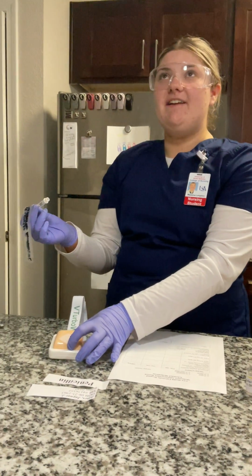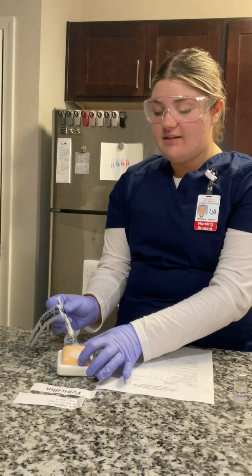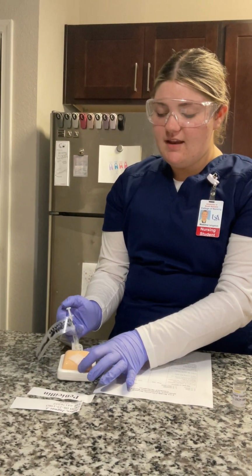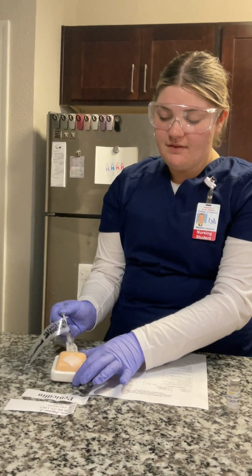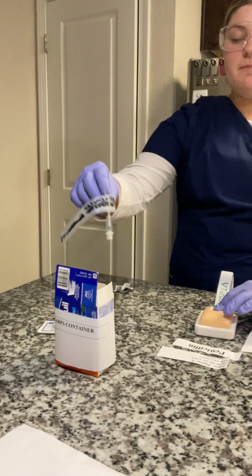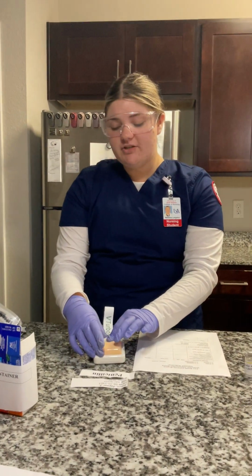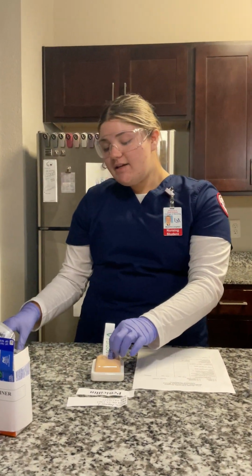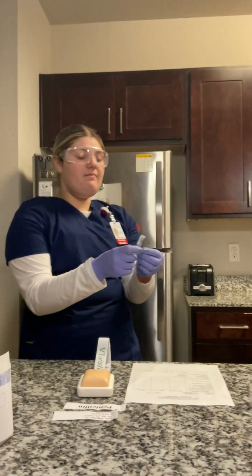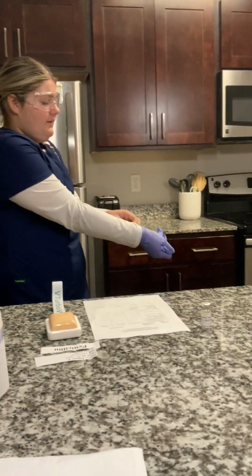Since it is a subcutaneous injection, you can do one or the other. So for this one, I'm going to inject at a 45-degree angle. I'm going to pinch the skin, and then I'm going to release the skin, and then I'm going to inject slowly. And then I'm going to pull out and apply pressure. I'm going to now dispose of my syringe in the sharps container. I will assess Mr. Jaguar Jones for any bruising or any allergic reactions. And now I'm going to dispose of my alcohol pad and my gloves. Put this in the palm of this glove.